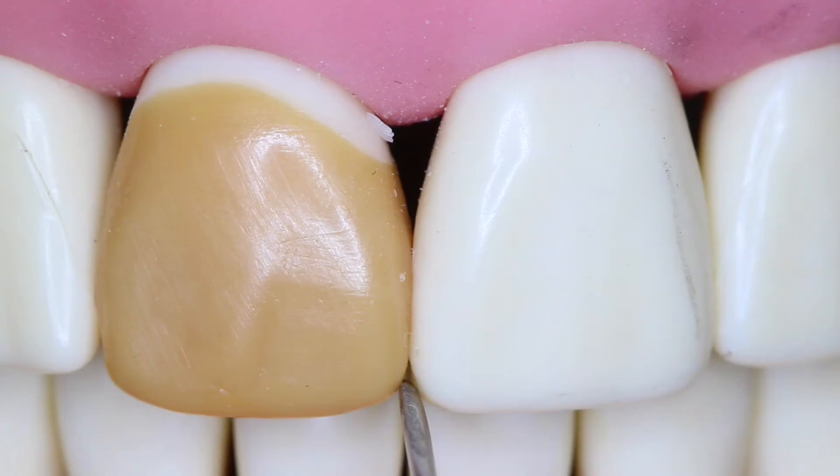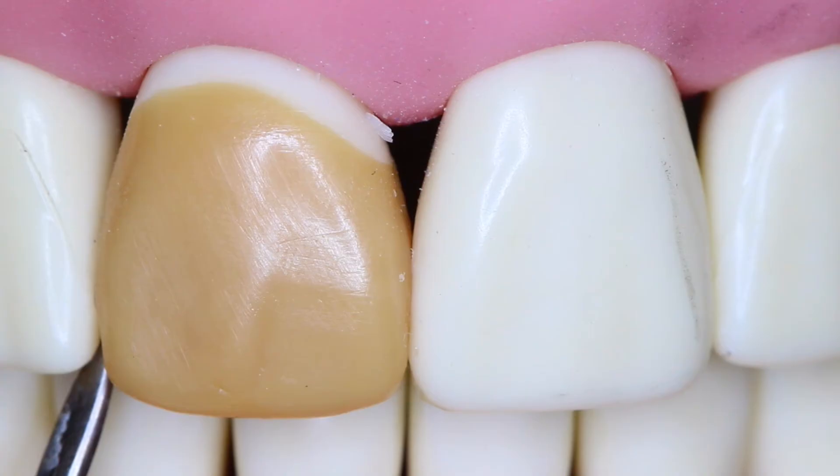Looking at embrasures from a facial aspect, number 8 is supposed to be a mirror image of number 9. Looking at the incisal, the mesial incisal embrasure — the shape is in the right spot but the incisal edge is too short and it is more of a rounded shape; it should be a little more square like number 9. Now looking at the distal incisal embrasure, the shape is correct, but the incisal edge of this wax up is more rounded — it should be flatter on the incisal edge. We'll talk about that again in a few moments.